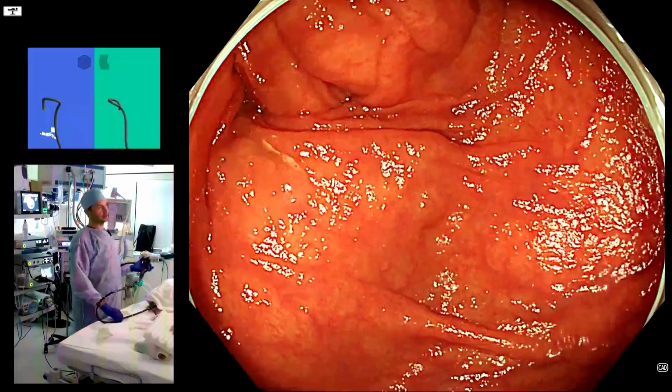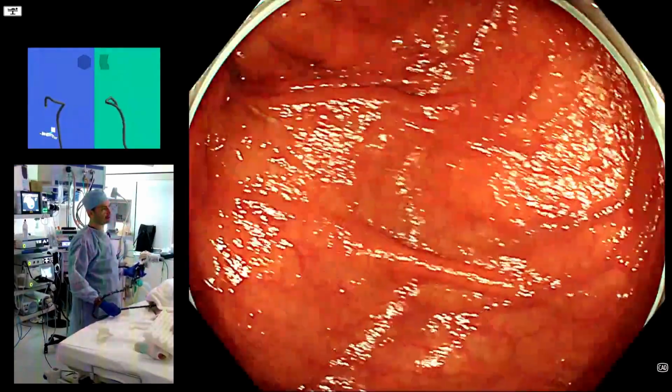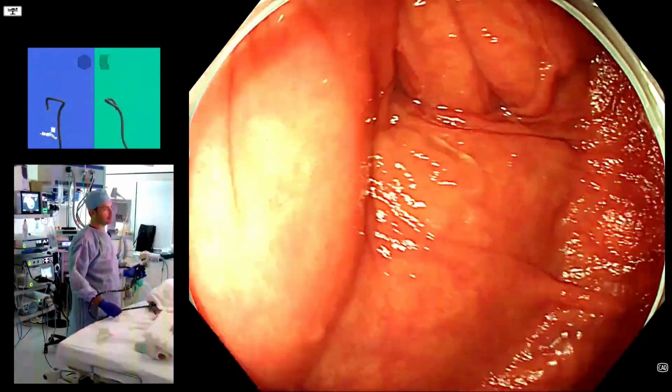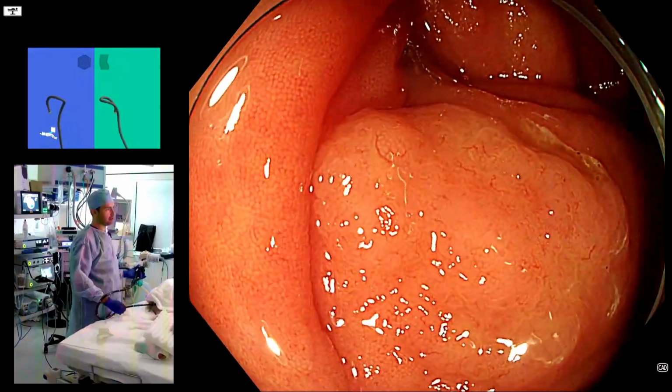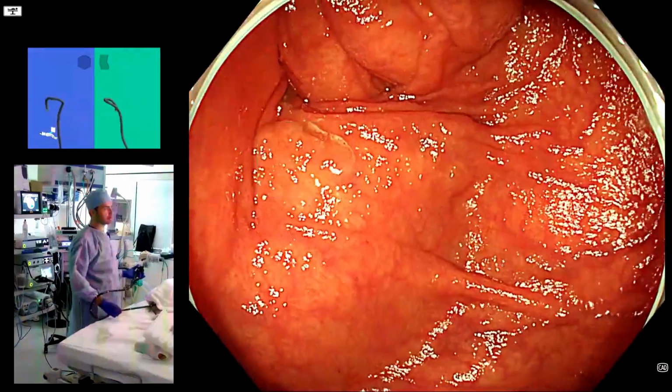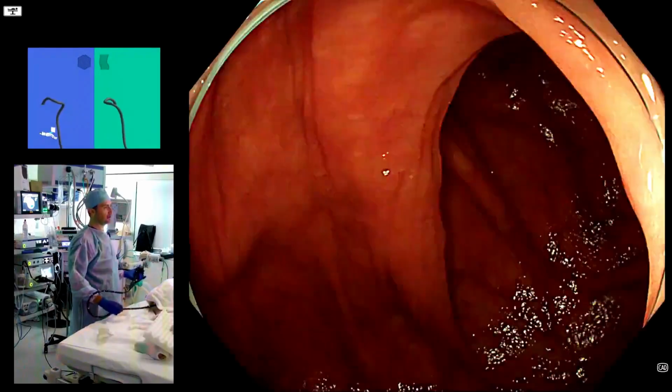So welcome to another little video snippet, and you can see AI a little bit pulsing there on a serrated lesion, but maybe it's not so obvious until you get really up close, so you have to be a little bit careful, especially if they have stool covering, although we're picking it up. But look, we're coming back, and we're just coming back.